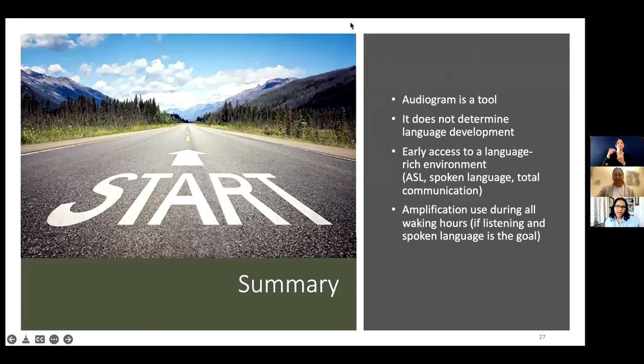This person is wondering what you would typically recommend when having difficulty getting reliable behavioral audiograms. And they give an example. Their 2.5-year-old gets pretty upset during hearing tests. They see the audiologist every few months, but they are having trouble getting reliable audiograms. The results indicate that his hearing difference is more important than we thought, but it is tough to know whether it reflects an actual hearing difference or lack of cooperation during the test. And it says we are recommended to do an ABR. So what say you?